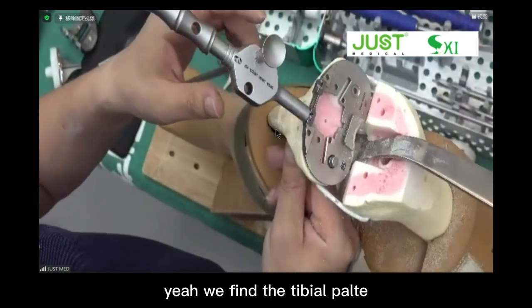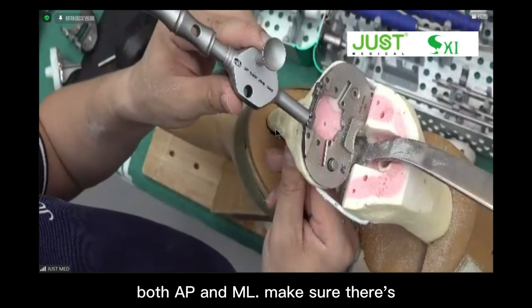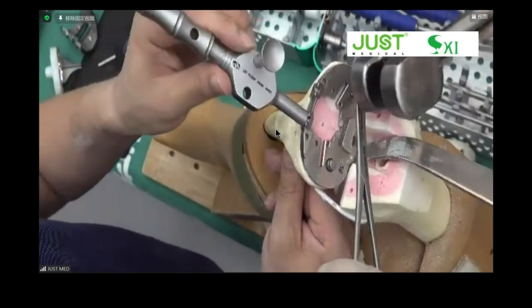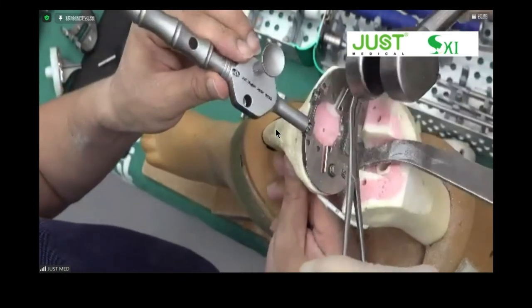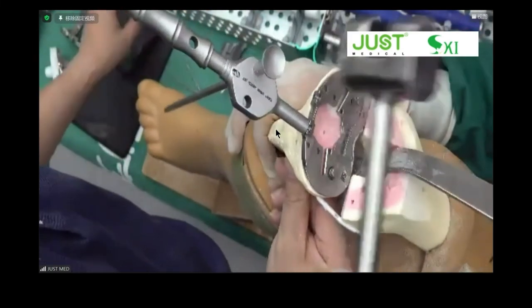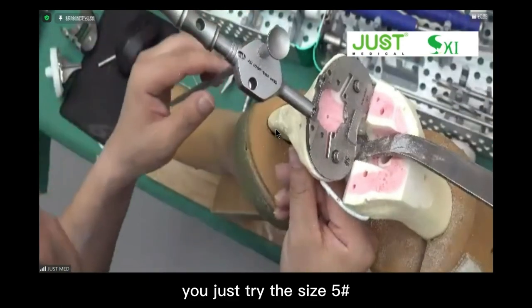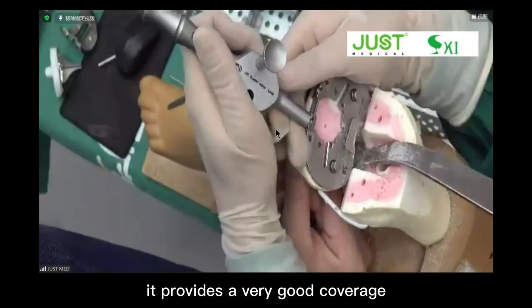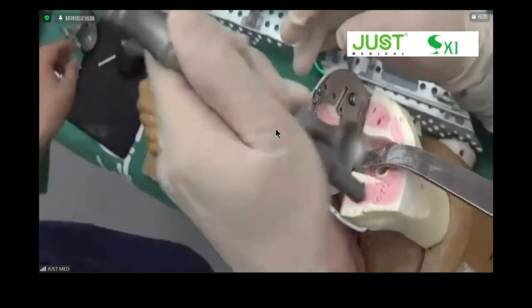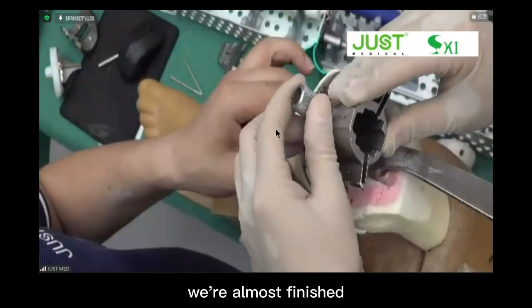We find the tibial base plate that provides the best tibial coverage, both AP and ML. Make sure the posterior medial bone is exposed. Make sure it's slightly external. So you just try the size 5. It seems very good. It provides a very good coverage. Then we're going to do the tibial stem preparation. It's almost finished.